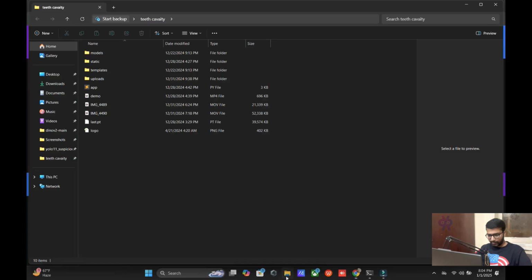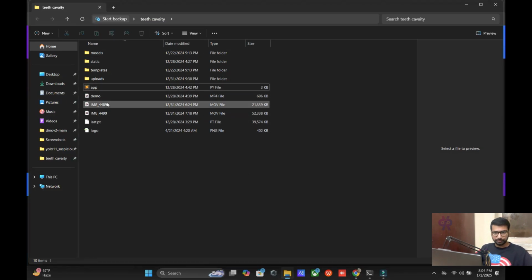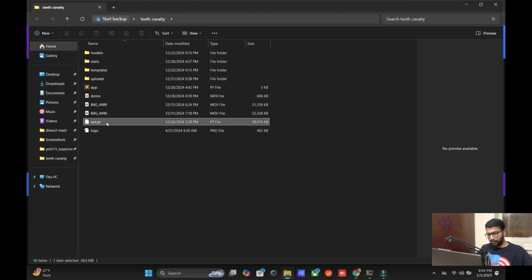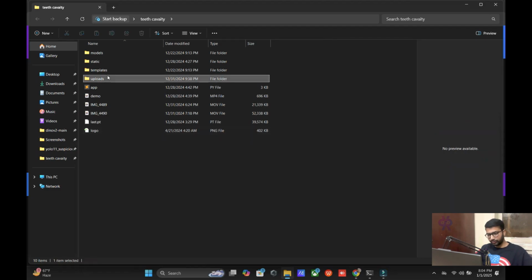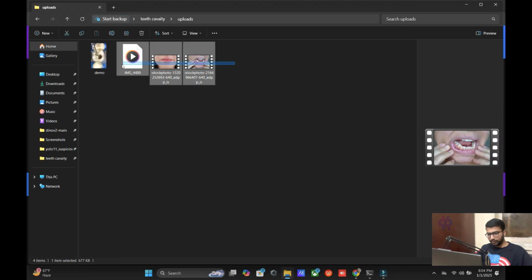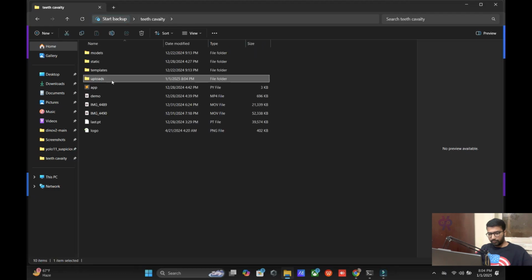So put it here. Okay, so we need videos of the mouth. We open the mouth and record our video, and here is our last model. Here is our logo. Okay, no, the logo is not used. You can see the uploading folder. Here you upload the videos. Okay, result, and now template.